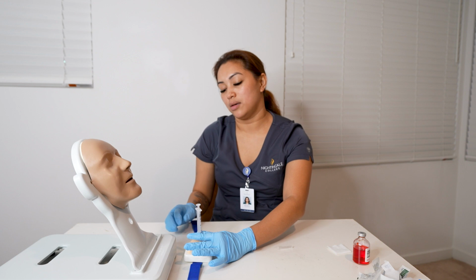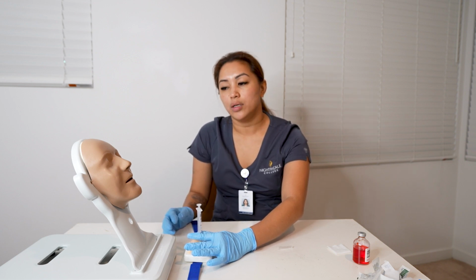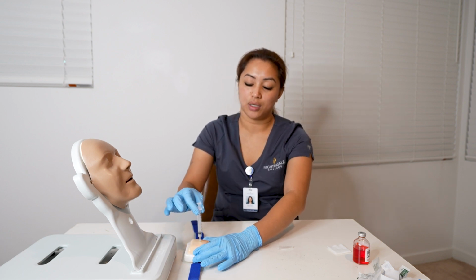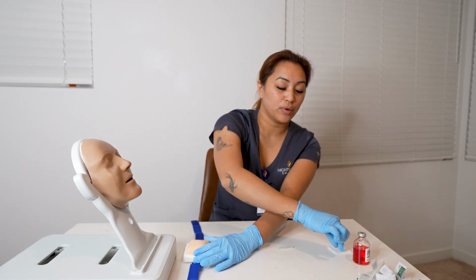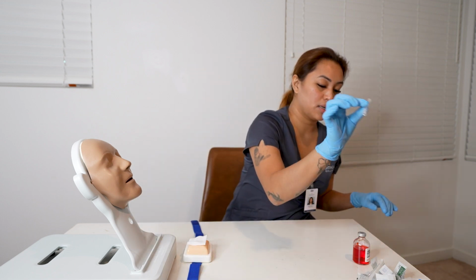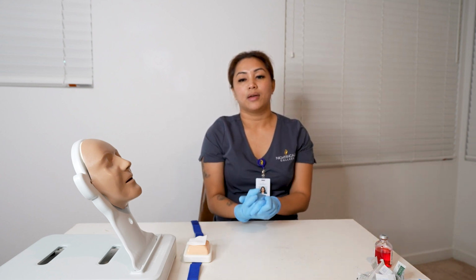Now that it is injected, now we have to wait 10 seconds. 1, 2, 3, 4, 5, 6, 7, 8, 9, 10. Alrighty, perfect. So now we are going to withdraw the needle, dispose of this into the sharps container. Now we're going to get the gauze and just gently place it over the IM injection site. Now I'm going to place this in the right bin. Put the medication away. Alrighty, perfect.